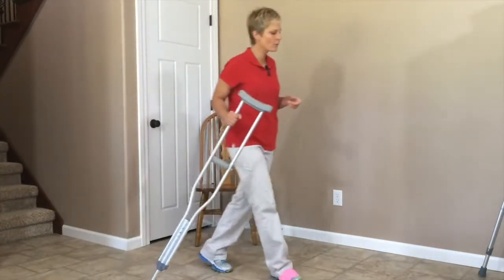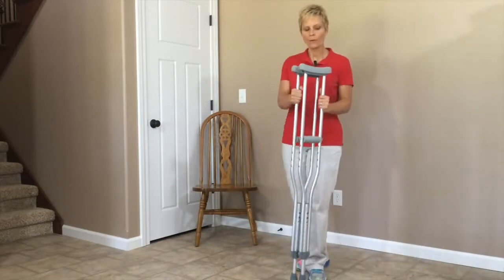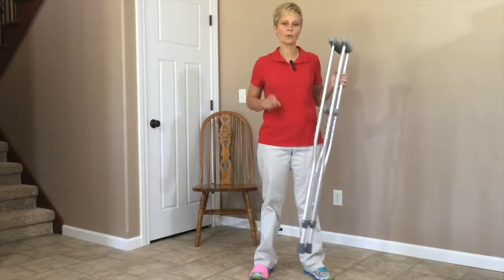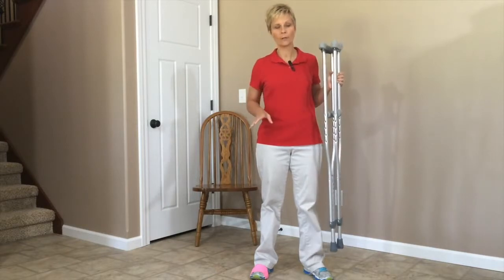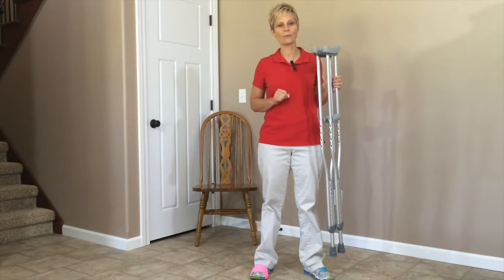That's how to walk with crutches with varying degrees of weight bearing. Also, be careful when you come in from outside with the crutches. If you've walked on gravel or been in the rain, the bottoms will be very slick. If you get on linoleum or a wooden floor, they could slide right out from underneath you, so be careful.